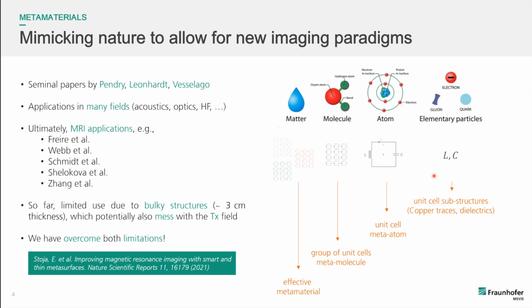In the early work, they showed that you can use this to locally enhance your magnetic field and get a higher signal-to-noise ratio on both the transmit and the receive radio field, which means that you can get signal, at least in certain regions, which is 10, 20 times higher than what you're used to from your conventional setup.